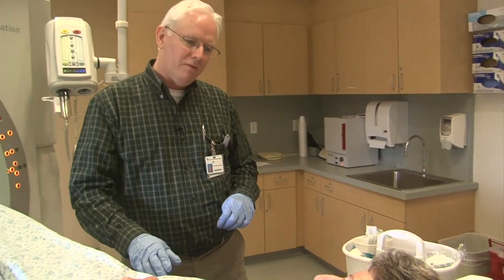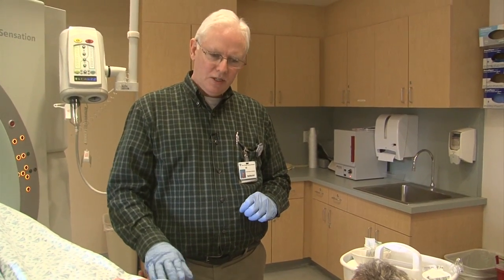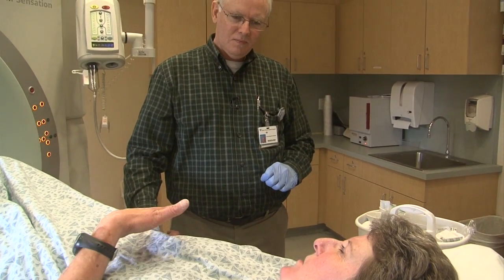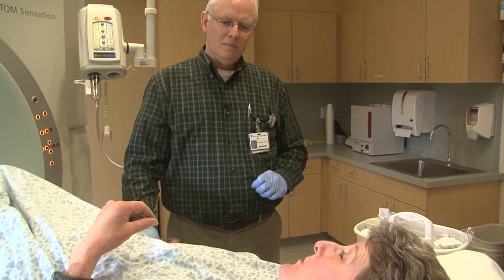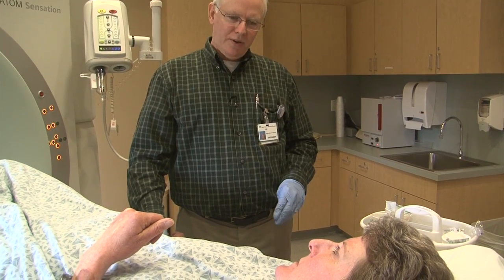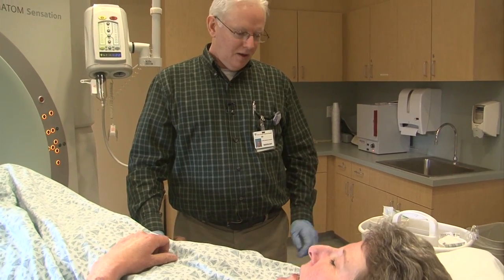I just wanted to confirm that you have no allergies to the contrast. Any allergies that you know of? No. Well, I've never had the IV contrast before, but I am allergic to shellfish. Well, that's not a concern. That will be just fine. Oh, okay.